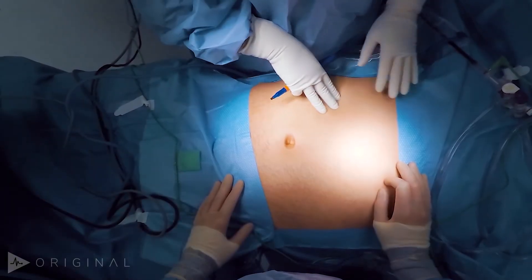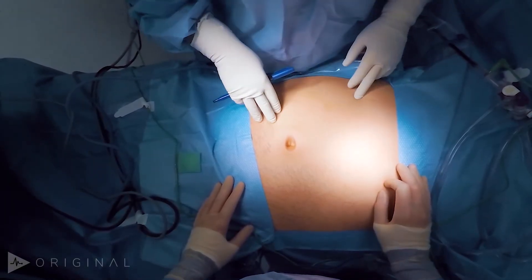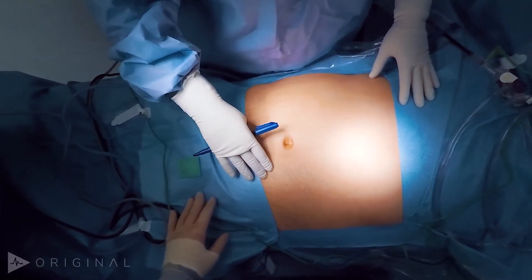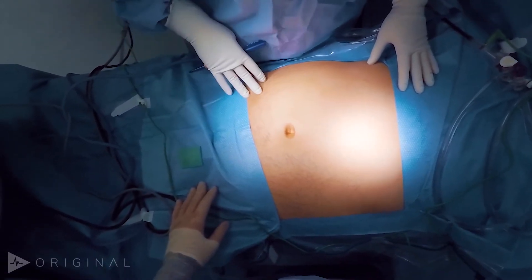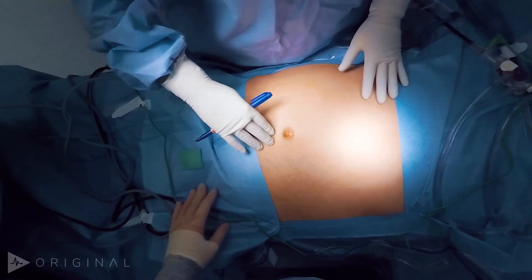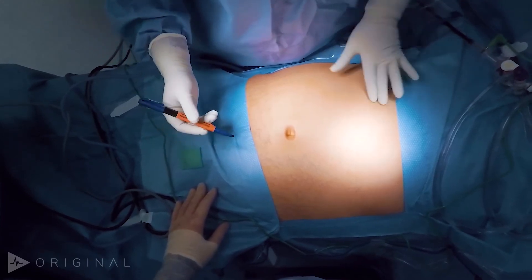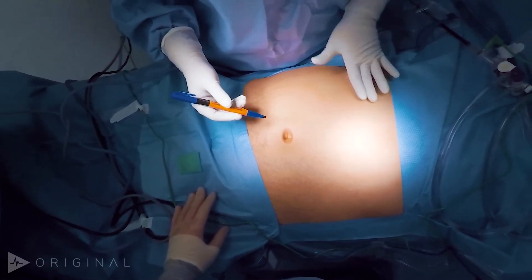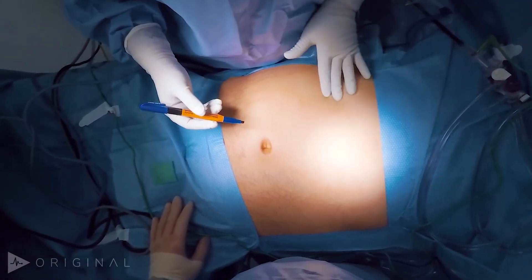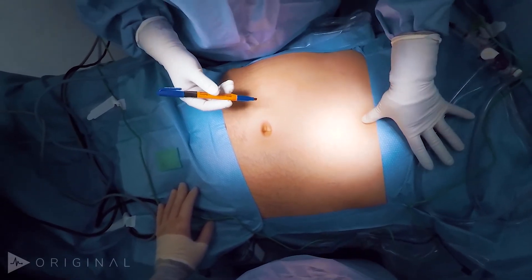That also made the case technically more challenging. Before we begin, we're just going to mark off a few landmarks on how we decided to plan our port placement. This gentleman has a BMI of 45 and central obesity, which is typical for males. The first thing I like to do is estimate where I would make a subcostal incision or convert to open.